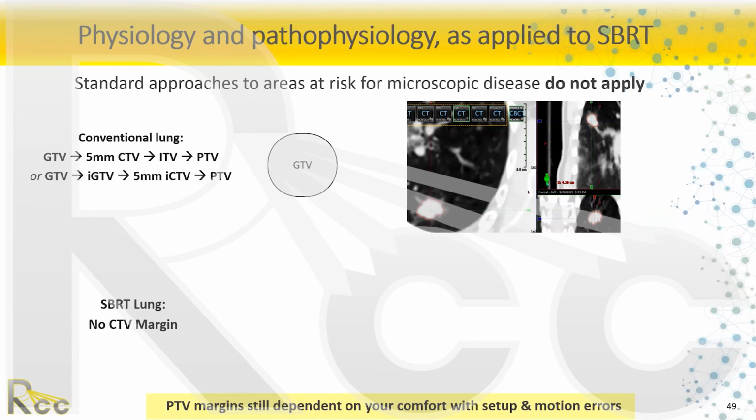So how much extra do you want to add to your target for any issues with setup or unexpected patient motion that might occur during your treatment? This is harder to do clinically because they're asking you to expand a microscopic margin for what might exist nearby. And then they're asking you to draw out the motion of that microscopic area, which can get tricky as you're up against tissue boundaries. Most people do this.